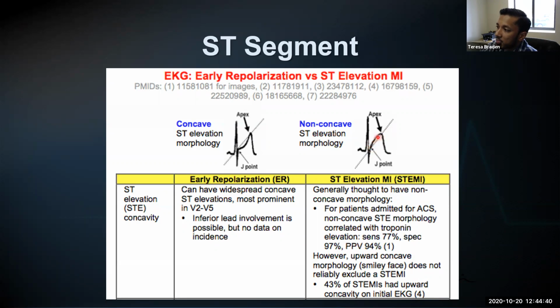But if you drew this line, what you could see is now that more of that ST segment is on the top part of that line. So maybe it's more suggestive of a non-concavity or a convexity, which is more concerning for that tombstone ACS type appearance.